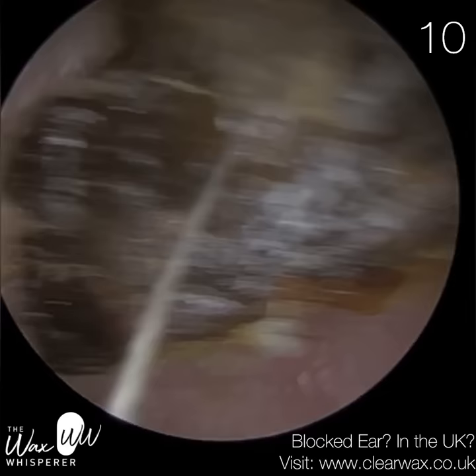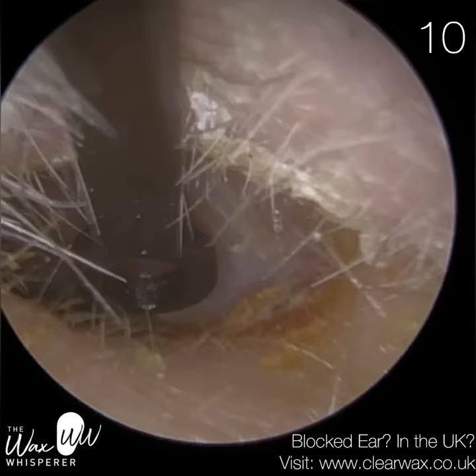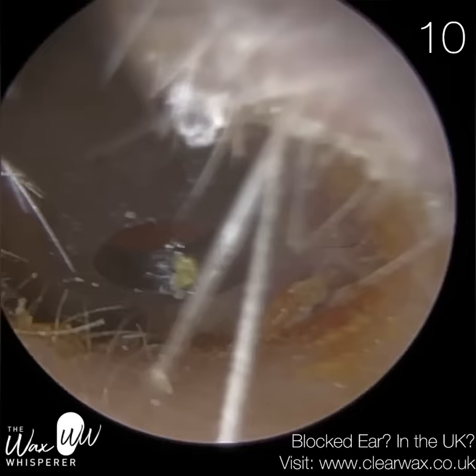Patient ten — quite a crusted plug, left ear. This patient's ear canal, like all of our ear canals, has an upward slope of around 32 degrees — this patient's is just slightly more. As we approach the eardrum, the ear canal drops about half a centimetre away, downwards, and that creates what we call an inferior recess — a little basin or trench, if you like.